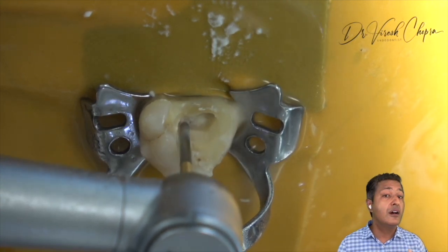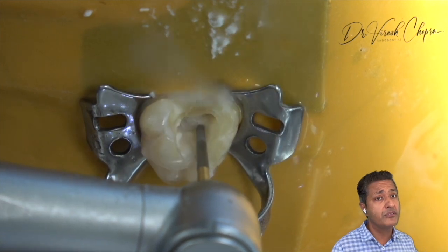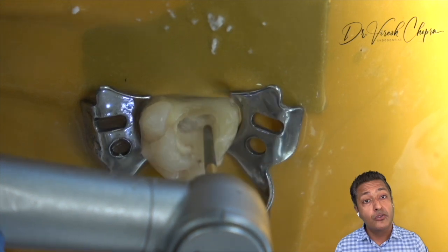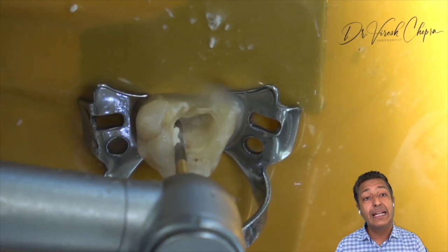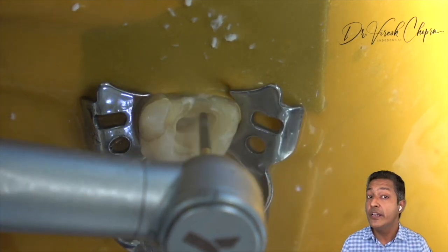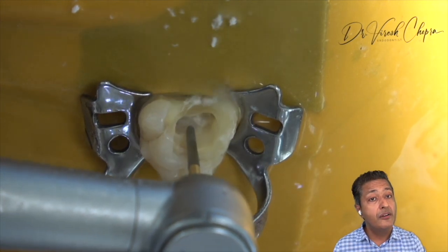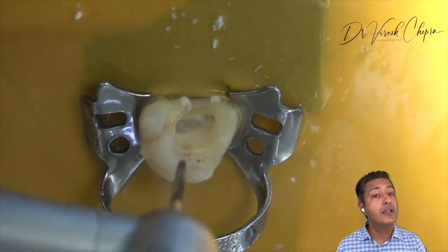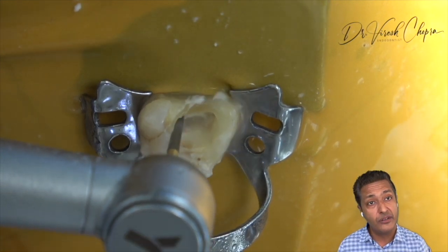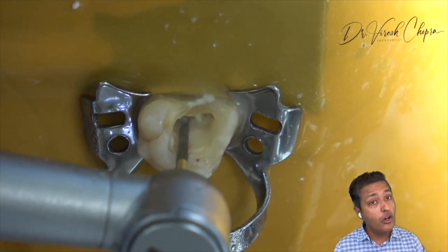Yes, there are a lot of newer conservative access cavities coming into the picture, but right now we are talking about how to perform an ideal access cavity. So once we know that this is the depth where we found the drop or the exposure, we don't need to do any vertical cutting anymore. You can see on the screen right now the burr is only cutting on the lateral aspect of the wall, not in a vertical direction. So the movement has to be only lateral, and you need to cut wall by wall.